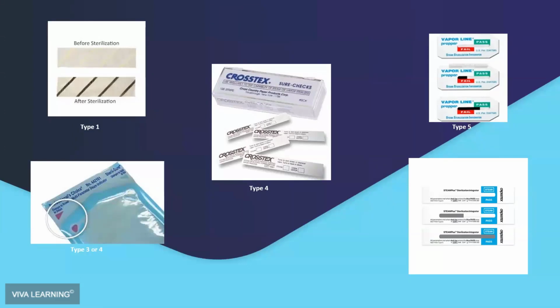That does not apply with these types of packages. It has to do with the integrity of the pouch itself. Another question, is it more common to use the type 3-4 in a dental office? I'm not sure exactly what that question is asking, so if the asker of the question could clarify that, that would help.